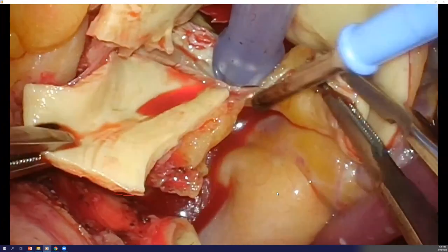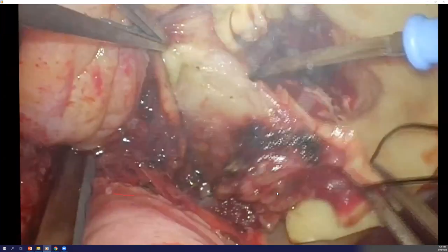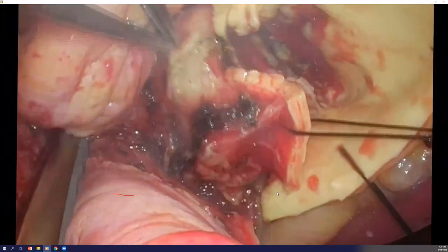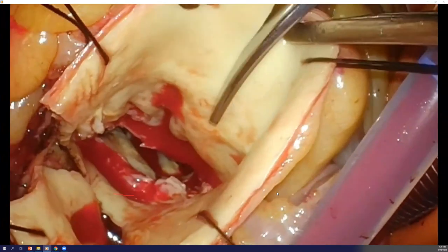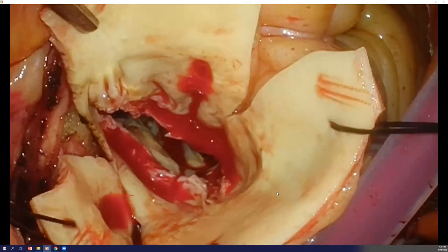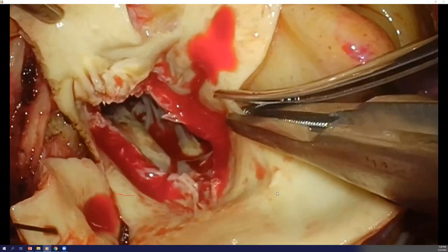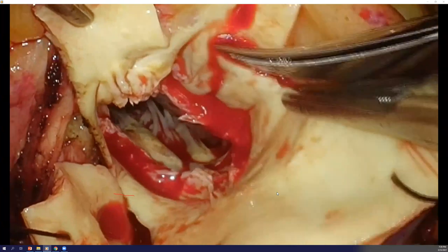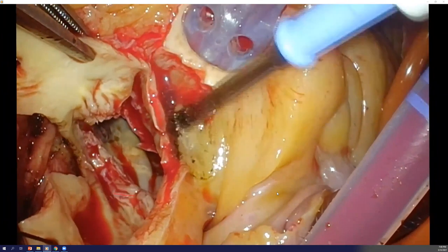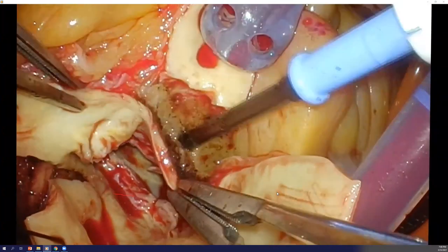And then secondly, in terms of mobilizing, you can see the cautery here is mobilizing the aorta away from the coronary rather than the other way around, which is also important. Because we're doing a Ross, I'm mobilizing behind the left main just to mobilize the back of the PA as well. And then we mobilize the right. You see two straight lines on either side, leaving about 2 millimeters of aortic wall on either side, and then connecting both of these at the bottom. And then with low-grade cautery, burning the aorta away from the coronary and not over-mobilizing that coronary. Otherwise, that's how you can get some kinks when you reimplant. Just burn that little fat, dissociate the coronary from the aorta, and that's all you need to do.